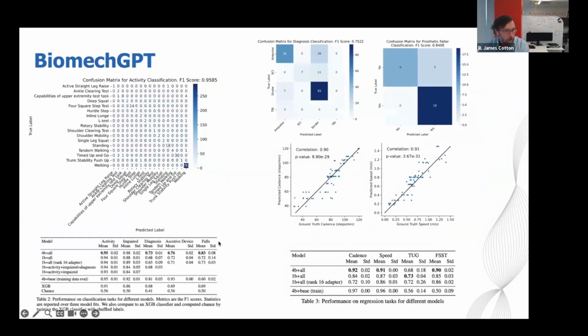Yeah, there it is. So I just went and started with these ones and added diagnosis, assistive device, and falls. And then we added in the timing-based tasks. I mean, there's obviously a lot of permutations. We were thinking more just add more and more things. And we're starting now, like we have an annotation dashboard for getting to a lot more fine-grained annotation to really start building more detailed motion scripts of what's happening. I hope it'll just continue to get better, but we weren't trying to figure out what we could strip out with the least devastation.